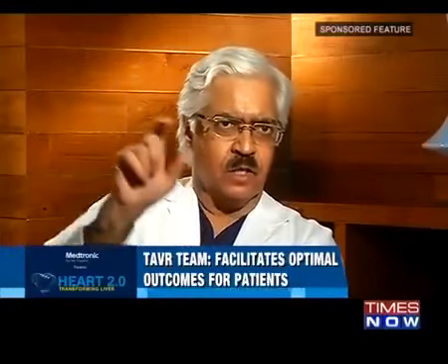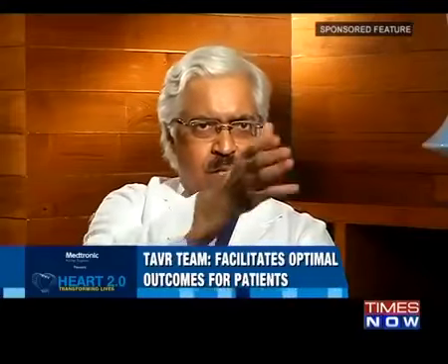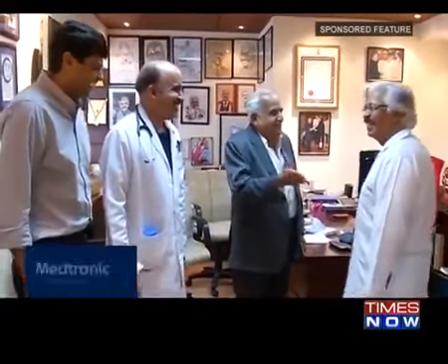We must remember that this decision of offering Mr. Ori the TAVR procedure was not my advice or an individual's advice. It's the heart team which sits together and decides for the patient: is he going to be really high risk for surgery? Is he suitable for surgery? Should we consider the other way, which is the transcatheter way to implant the aortic valve, and which would be the safest and the best procedure, giving Mr. Ori the longest term results?